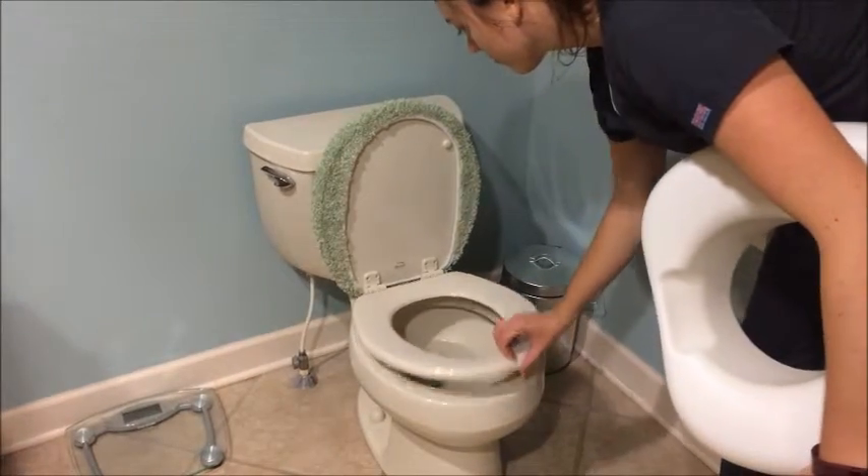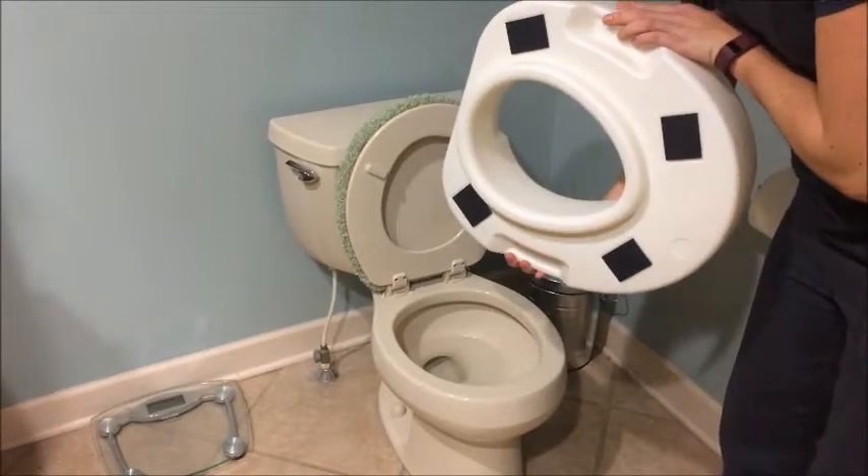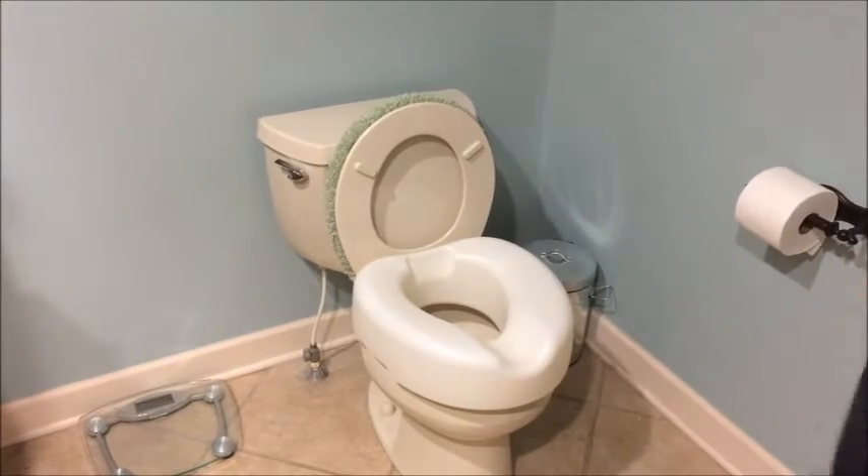To install, first lift the toilet seat and lid. Next, place the raised toilet seat on the rim of the toilet. The lip on the bottom of the raised toilet seat should fit into the toilet opening.